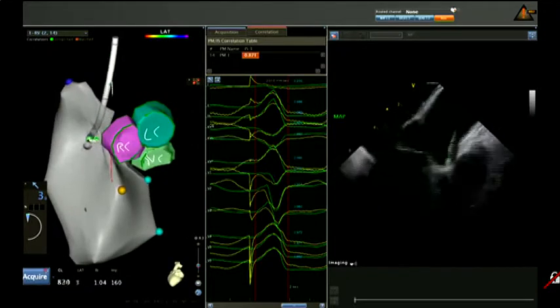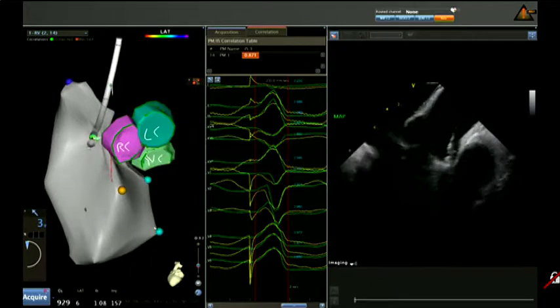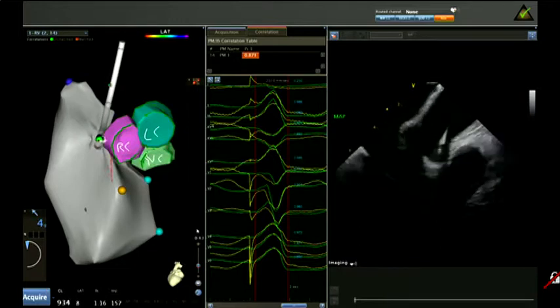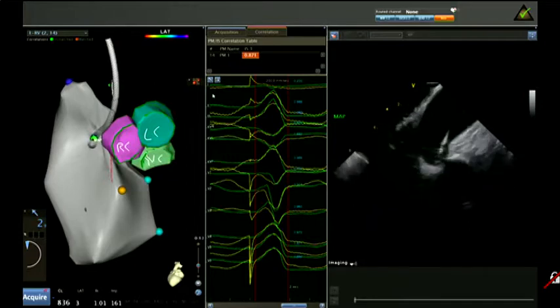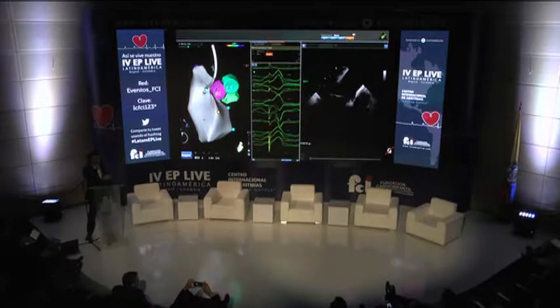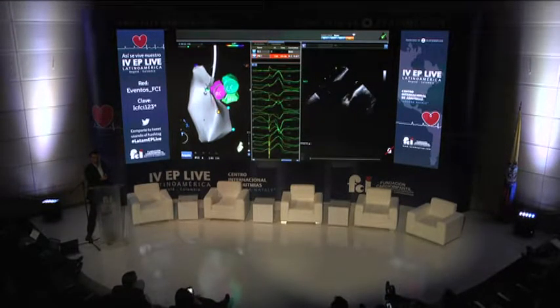I will show some anatomy slides. This is the outflow tract of the right ventricle. This is the pulmonary valve. This is the septal wall, but remember that this is not a real septum. And the differential diagnosis should be in the opposite structure. It should be either here or in the right cusp. And this is an ECG which is more suggestive of the right cusp. So I think this is a good clarification. Very well, Diego, you can go on.